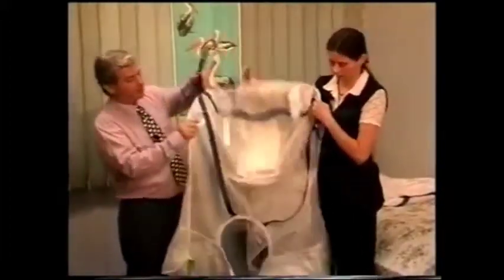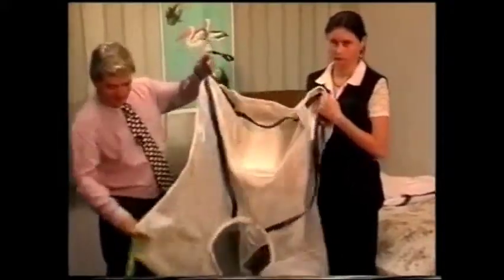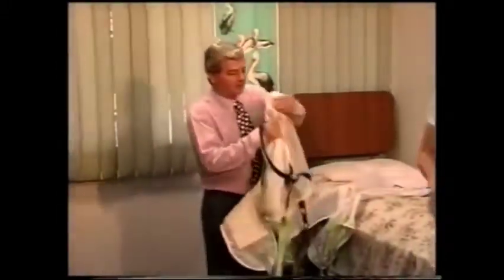All the webbing, you'll note, is sewn onto the outside of the sling. And in the netting slings, the foam that's in the leg section is a special foam that won't absorb water. So when you lift the person out of the bath, it minimizes the amount of drips that you get coming down from it. All right, so that's a Premier sling.